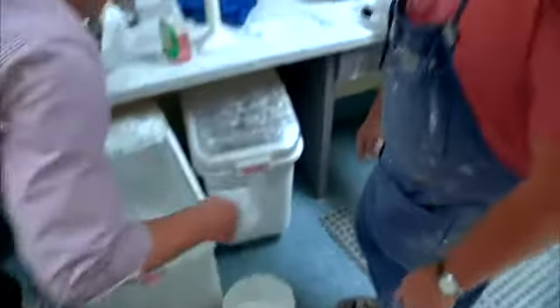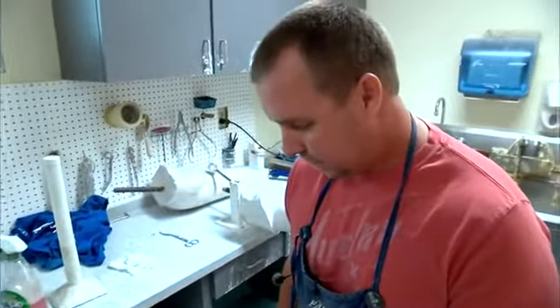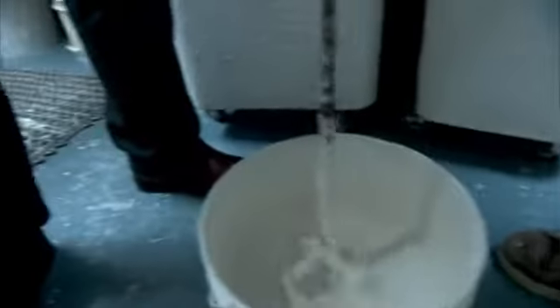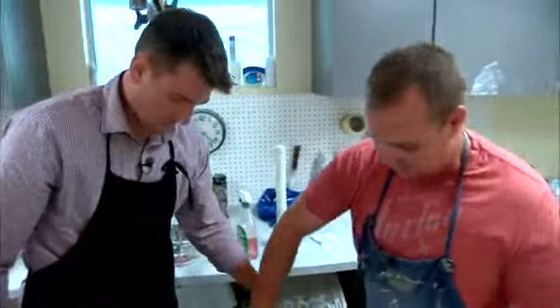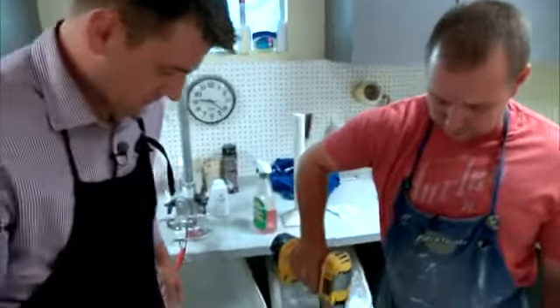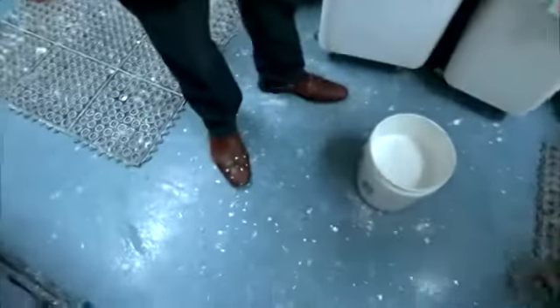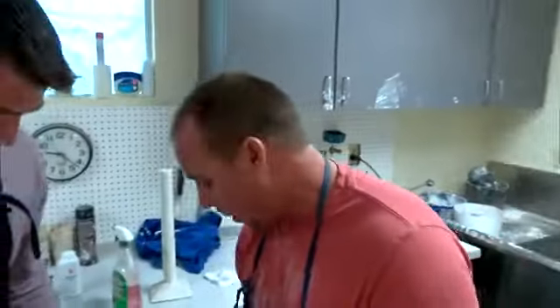We poured the plaster into the mold, filling it all the way to the top. There was a small spill along the way, but we got it sorted out and poured the bucket inside the mold.